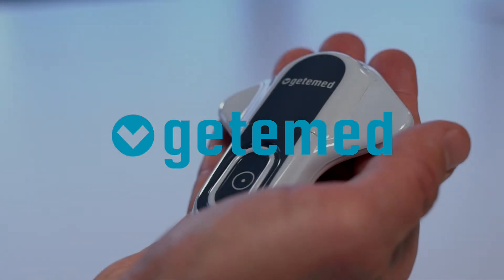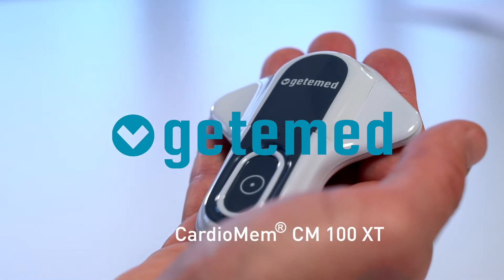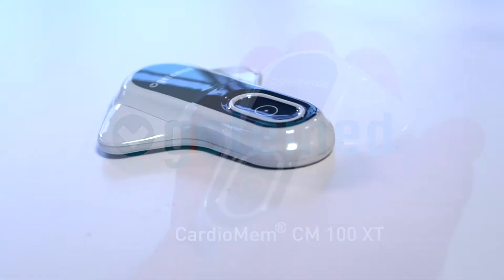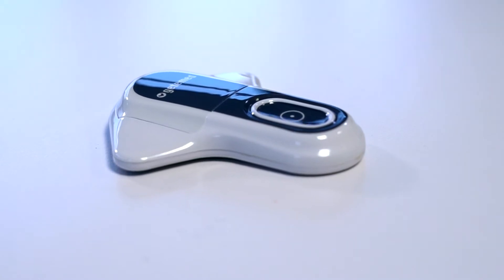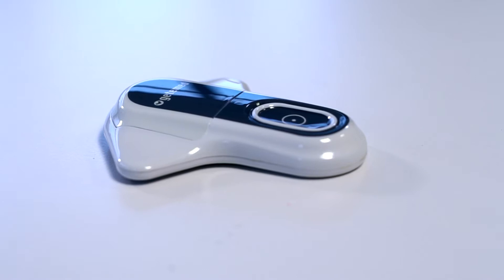Hello and welcome to GeteMed. Today we are going to explain how to use the ECG loop recorder CardioMEM CM100XT. The recorder is intended for the continuous analysis and recording of cardiac arrhythmias, such as tachycardias, bradycardias, pauses, and atrial fibrillation.